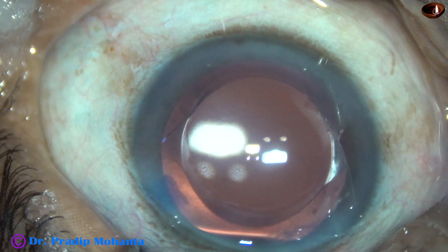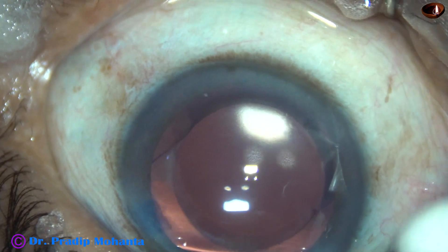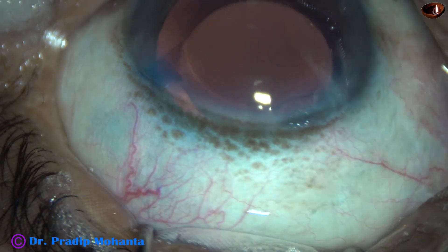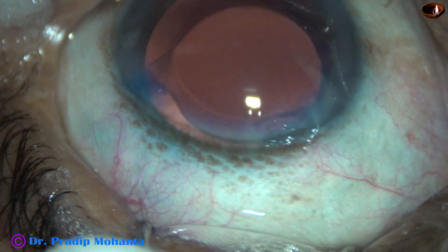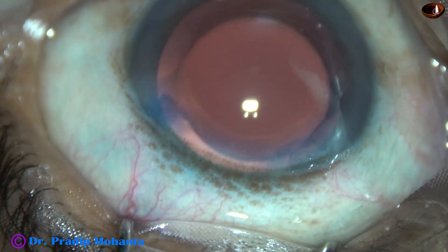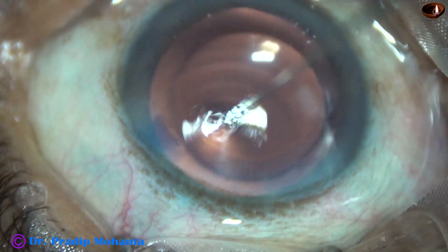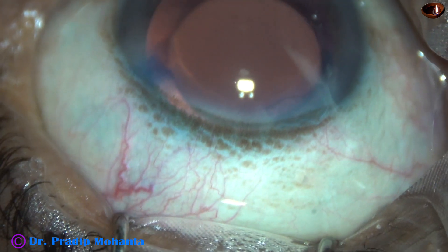The anterior chamber is formed very nicely and the integrity of all wounds is checked. There is no leakage from the right side port, which has not been hydrated. The main wound also shows no leakage and has not been hydrated. The case is concluded.